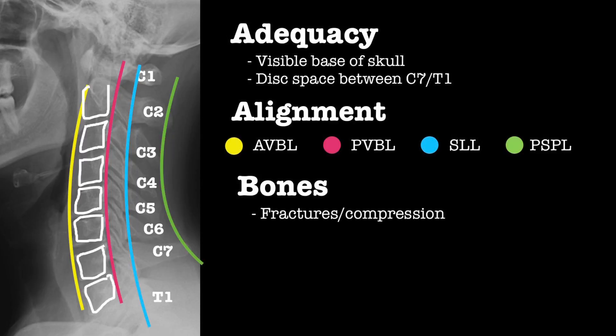B is for bones. Look for symmetry and chase the vertebral bodies looking for fractures. If there's asymmetry, this is likely caused by compression. If the compression is greater than 40%, there's likely a burst fracture, whilst anterior compression may be caused by a teardrop-shaped fracture.